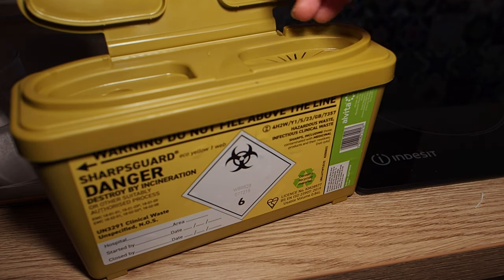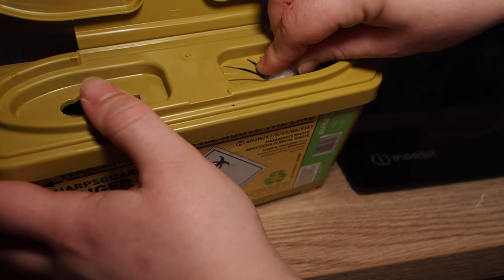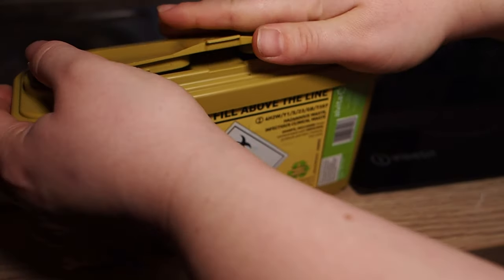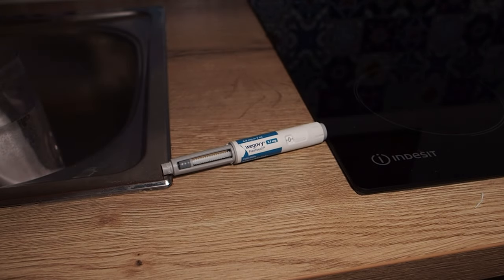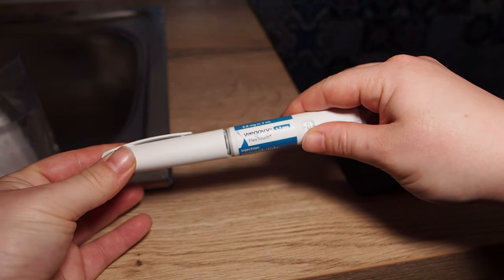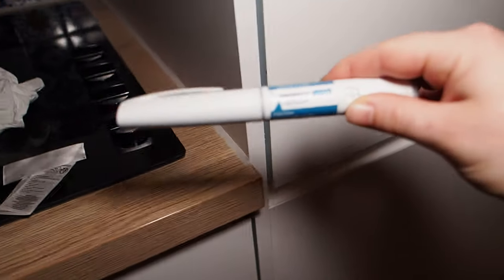Grab your sharps bin and make sure you're putting the needle in the correct way around — not the other way — otherwise you could end up needle-sticking yourself. Just put it in and then close it, not fully because otherwise you won't be able to open it. They do have a locking mechanism on the front. Then put it away somewhere safe where a child isn't going to get hold of it.